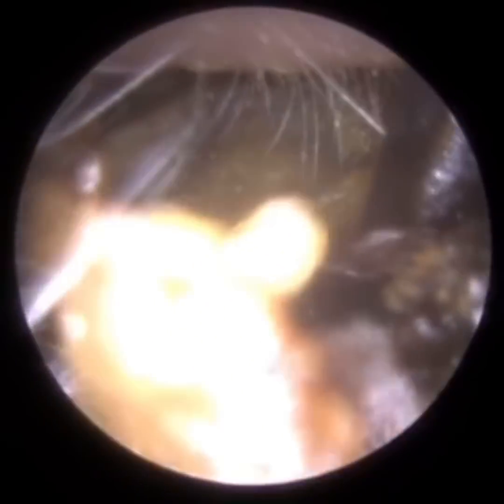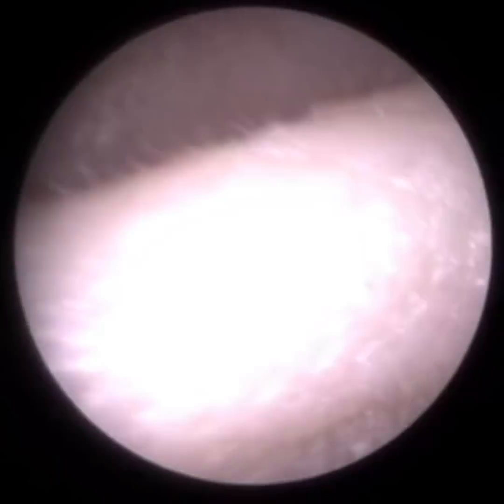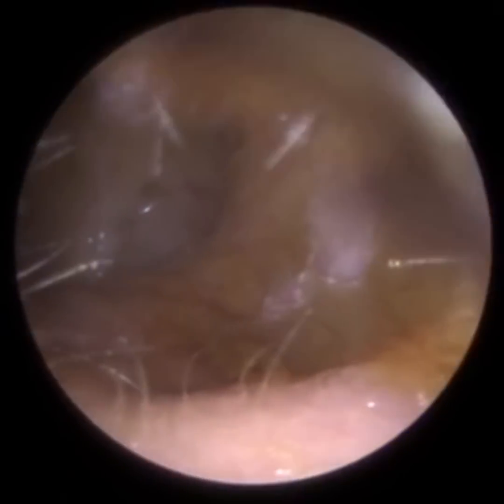With this patient they've got a mastoid cavity, and we purposely try to avoid suction wherever possible because the patient suffers from the caloric effect because of their mastoid cavity. Their mastoid cavity is what we call a modified radical mastoid cavity.